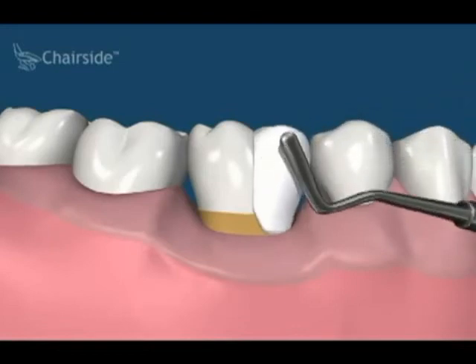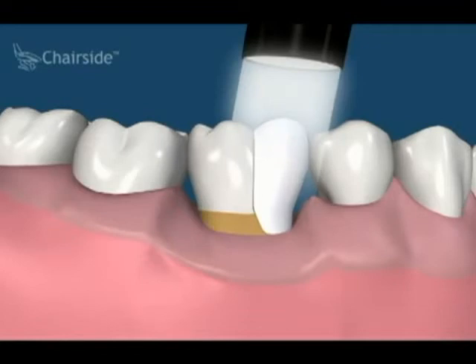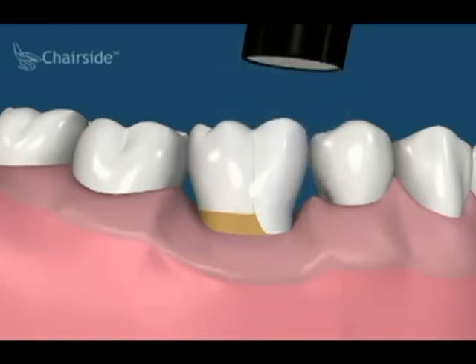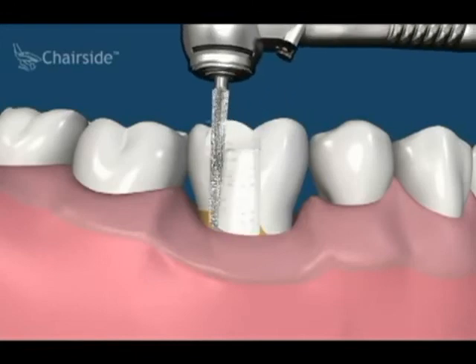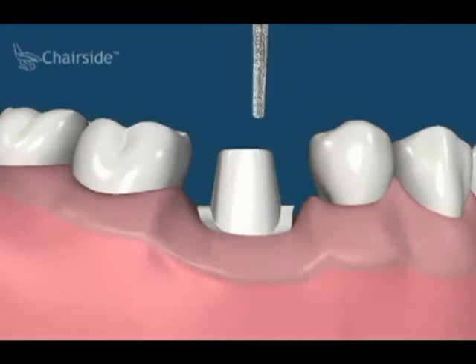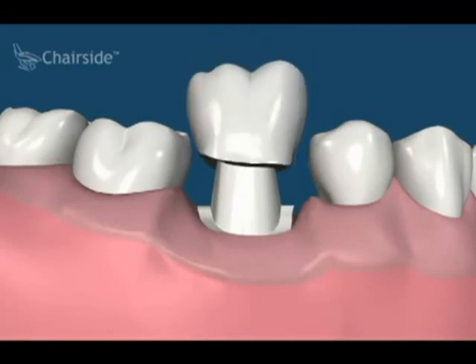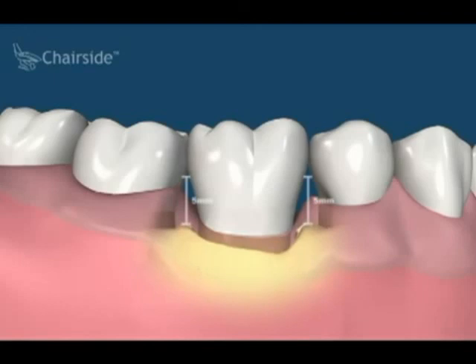In this situation, a light cured resin filling is used first to replace the lost cusp. This may be adequate in some situations, but the best way to restore a tooth with a large fracture is with a crown. The tooth is prepared and the crown cemented on top. Initially, there may be gum spaces missing between the teeth, but if the distance between the bone and the contact point is less than 5 millimeters, the tissue will eventually fill in these areas.